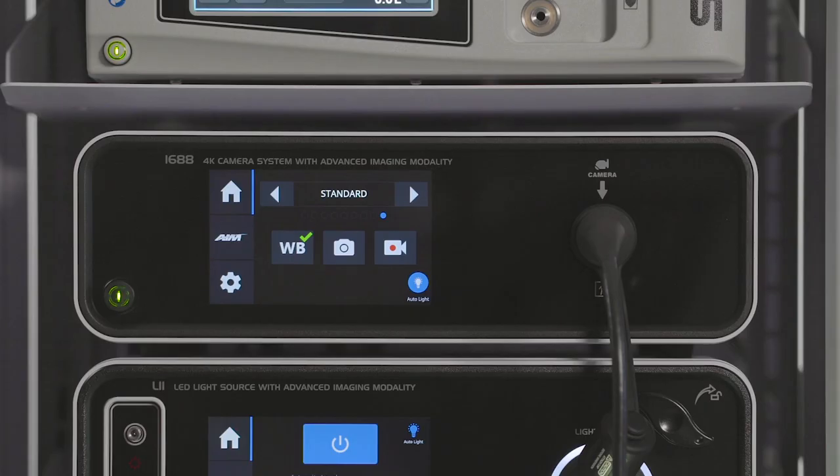Select the camera icon to capture a still image. A single beep will sound to indicate that an image has been sent to the digital capture. Select the record icon to initiate video recording. A double beep will sound to indicate that a video is recording. Press the icon again to stop the recording.